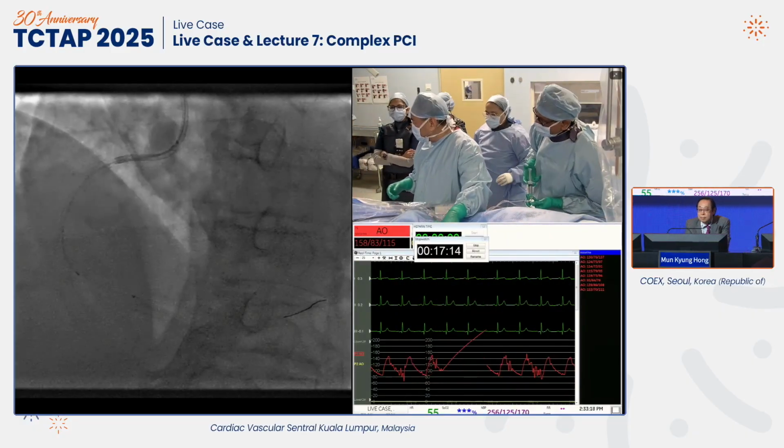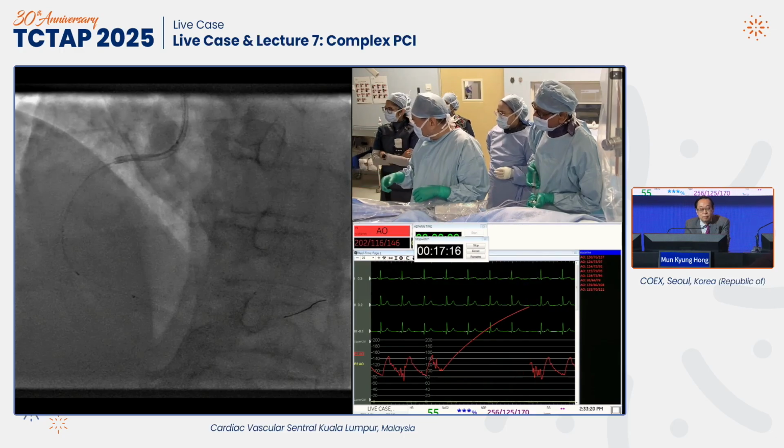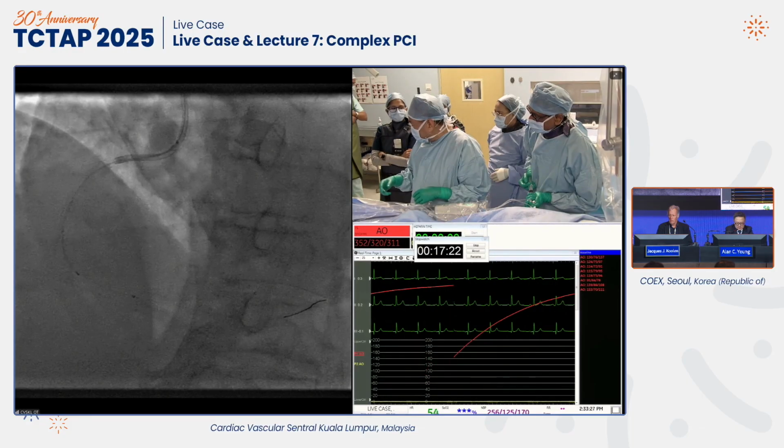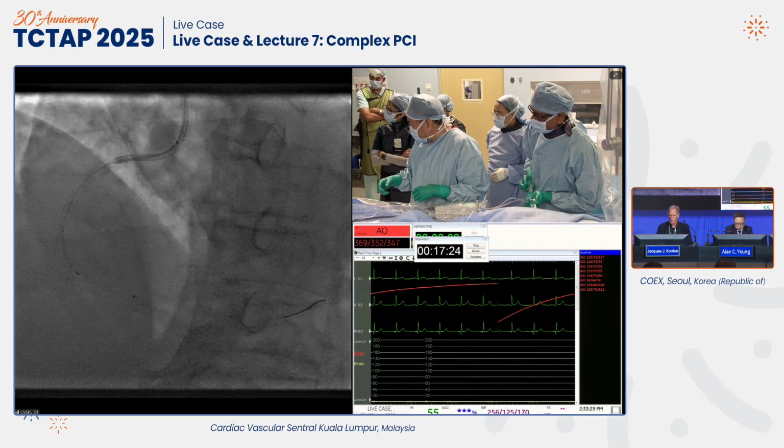Just give me 1 minute. I'll just take the OCT. Yeah. And then pull back. Okay, pull. Oh, it looks quite nice.